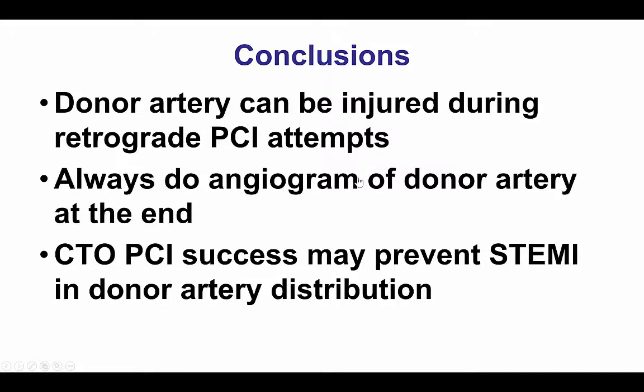What happened here, we had the collaterals going from the circumflex to the RCA, and those collaterals were reversed after there was cessation of flow into the circumflex, potentially preventing a full-blown ST elevation myocardial infarction in the donor artery distribution.